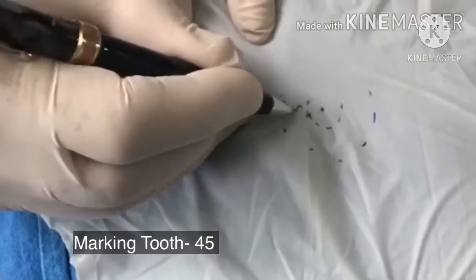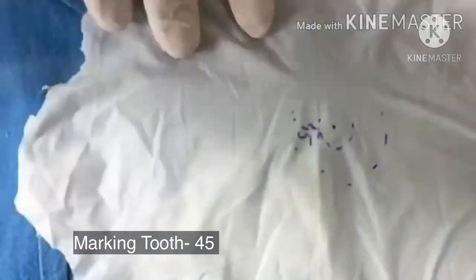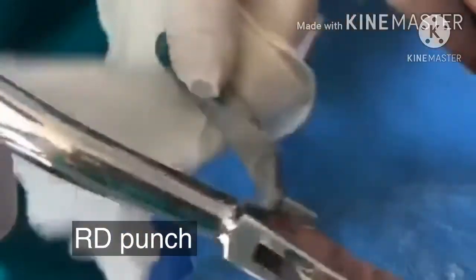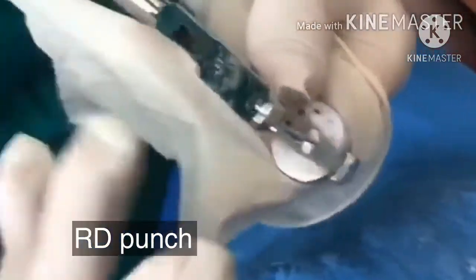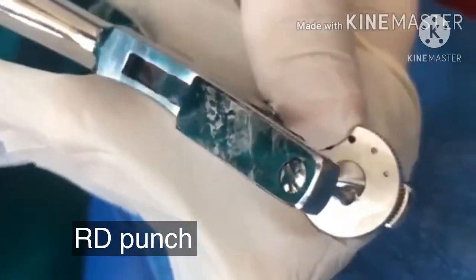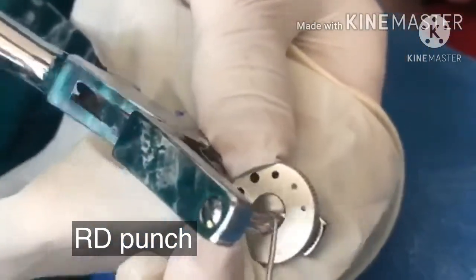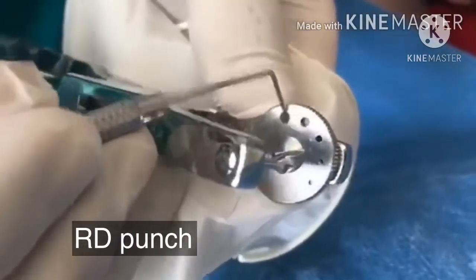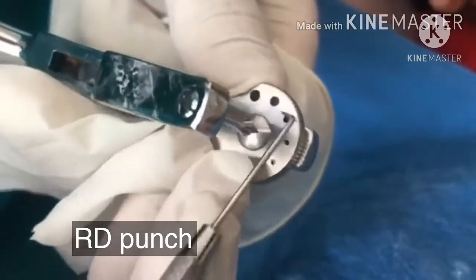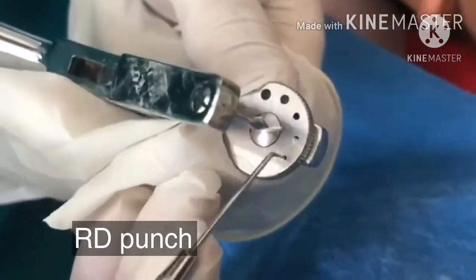So this is tooth four, five — the rubber dam punch. You can see the rubber dam punch. We have got five holes: one, two, three, four, and the biggest is five. The biggest is meant for large molars. Then there are holes for pre-molars, and the smallest one is for the incisors.